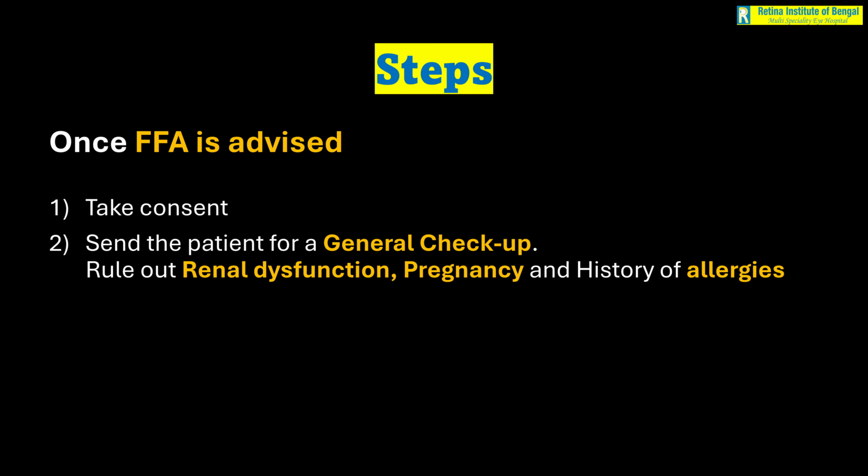Though, please keep in mind that just a slightly elevated creatinine is not a contraindication for doing angiography. And additionally, today we have an alternate way to study the retinal blood vessels, that is OCT angiography, which is a dye-less technique. And sometimes in this kind of situations where the renal parameters are deranged, probably it can be a safer alternative than fundus fluorescein angiography.